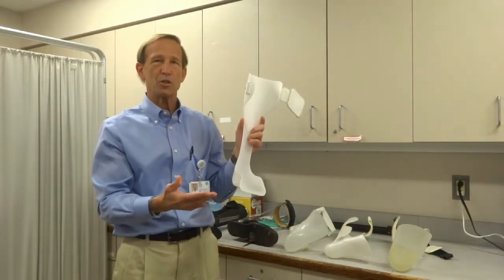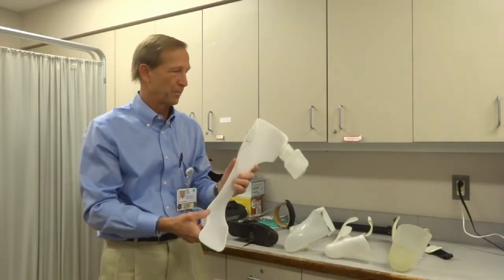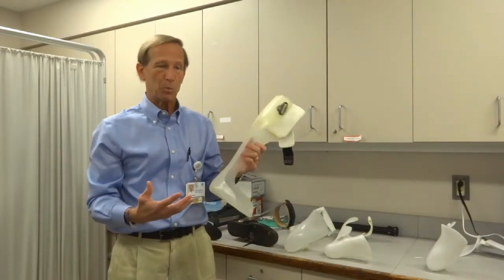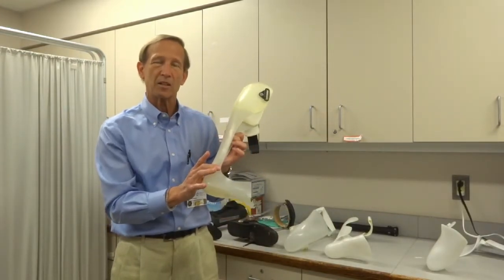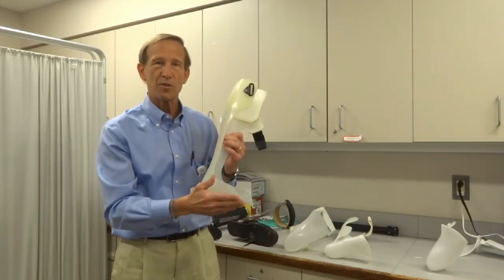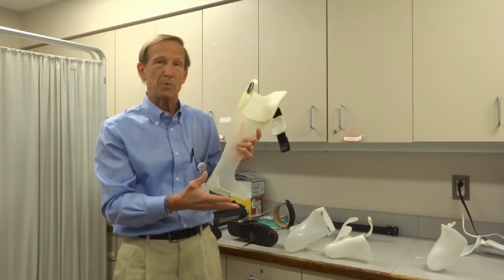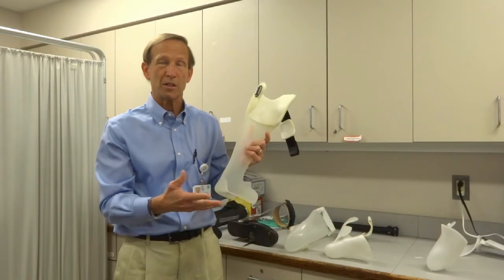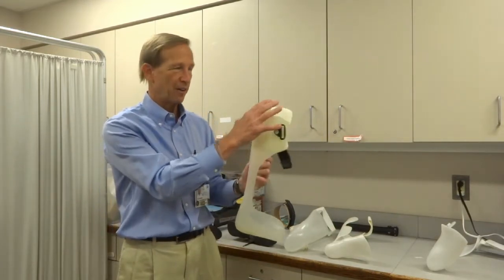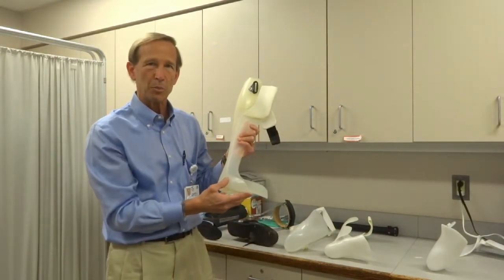This type is typically for conditions where your tone is low and there's no spasming of your muscles. If there is concern about needing more stiffness, we build more plastic around the ankle — that's called the trim line. The farther this comes forward, the stiffer the brace will get, giving stronger control, perhaps for a heavier person with increased body weight. We still have it all the way up to the calf, with a Velcro strap and foot plate, usually close to that 90 degree neutral position.